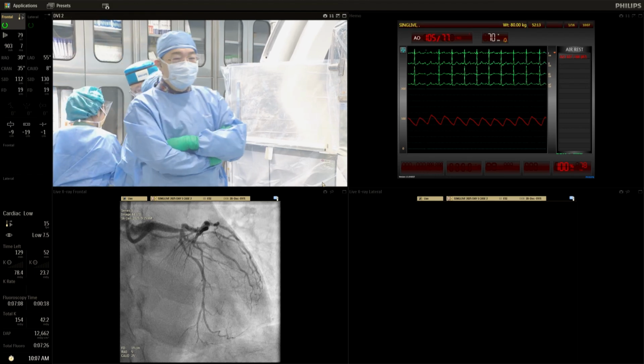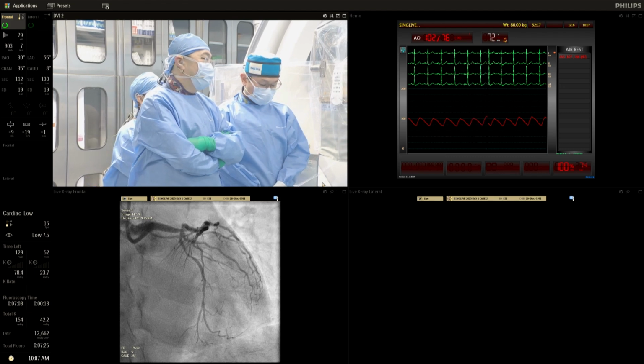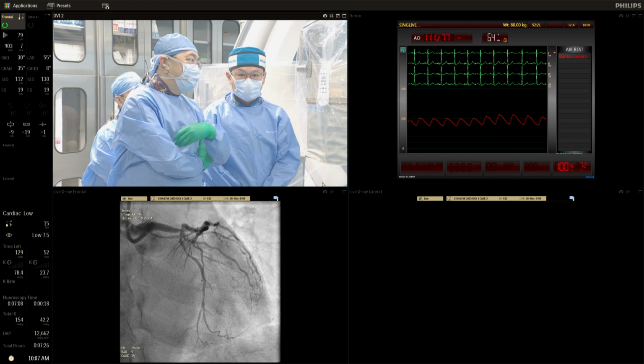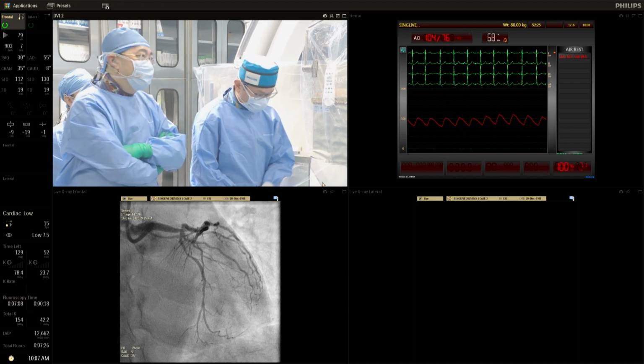Yes, so in this case, what sort of imaging would you be using? IVUS or OCT? Any preference, the panelists? Obviously, we selected our imaging strategy already.